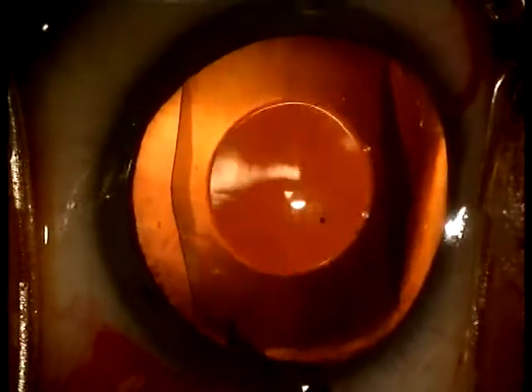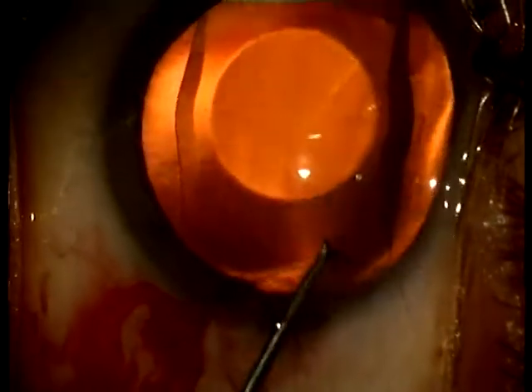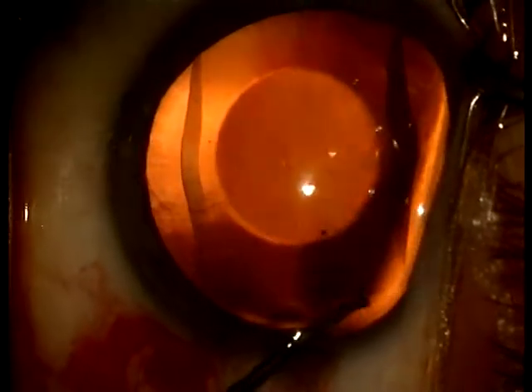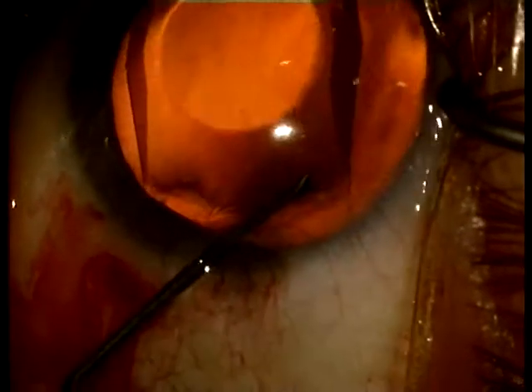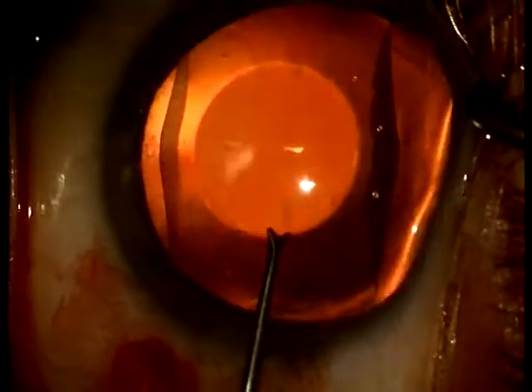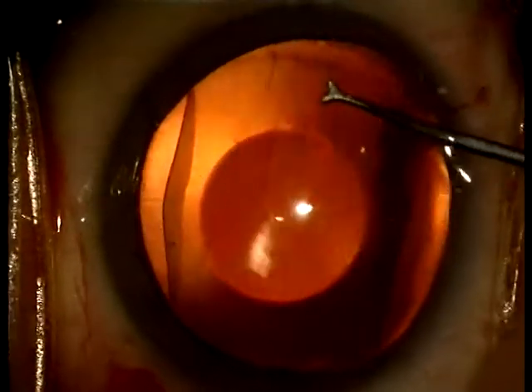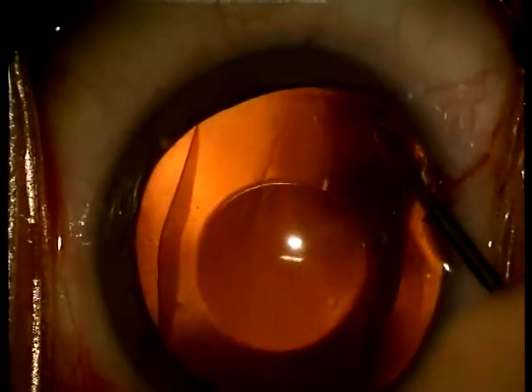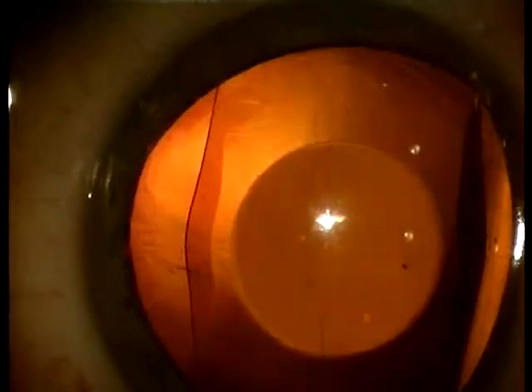With the toothed forceps and through the main incision the proximal haptics are placed behind the iris. Make sure not to touch the optic part of the ICL because of the risk of touching the crystalline lens. Through the paracentesis the distal haptics are then placed under the iris. Do this very gently and try not to touch the iris or crystalline lens.